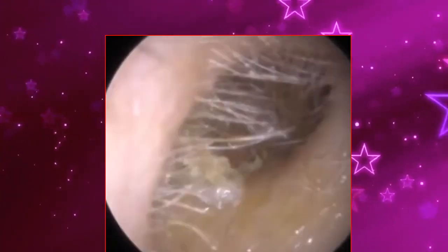You can imagine that just getting bigger and wider. It's got a lot of kinetic energy, that's the word I was looking for. It's stored a lot of kinetic energy. It's coming out much easier now. It's still quite a bit of a plug very deep in the ear, however. I think these gentle brushstroke movements.